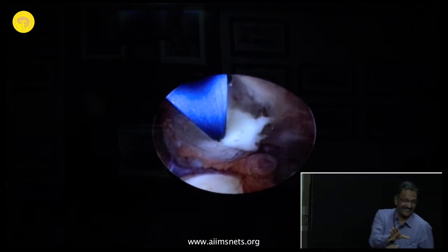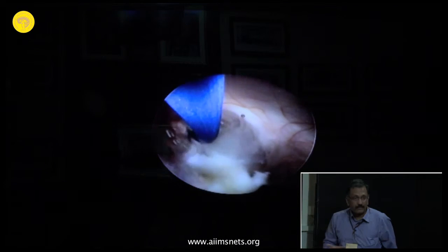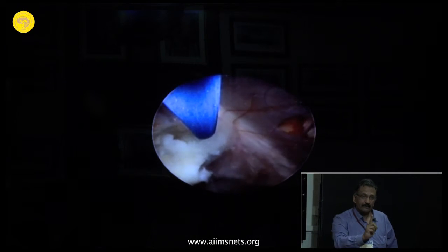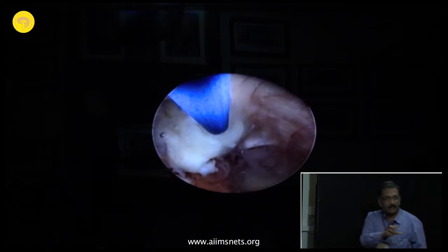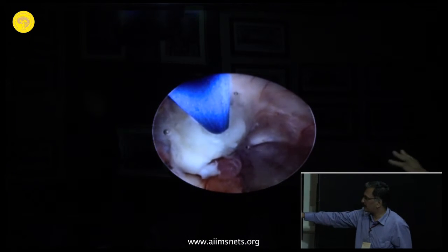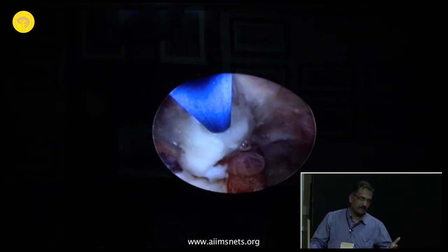The real life situation, okay? It's so difficult to take this out sometimes. And the last part of the capsule will always have a fibrovascular core, which is in the third ventricle. So please, you can just leave it alone. Leave that small capsule alone and don't try to do a total job, because this is a benign tumor. What is the maximum which can happen?